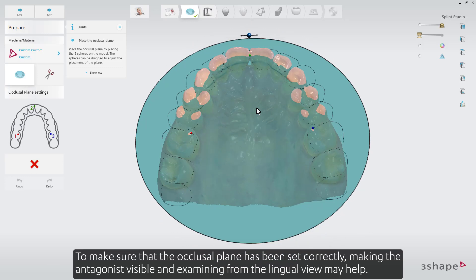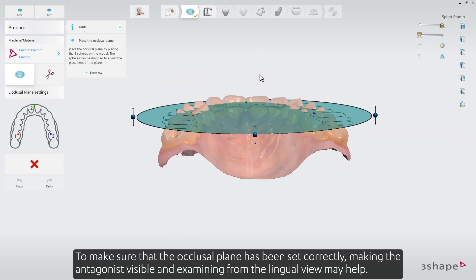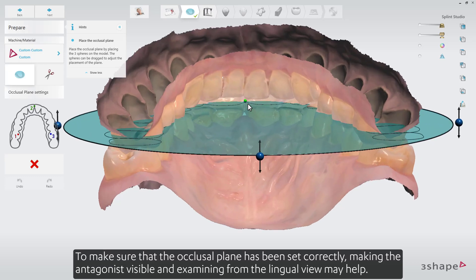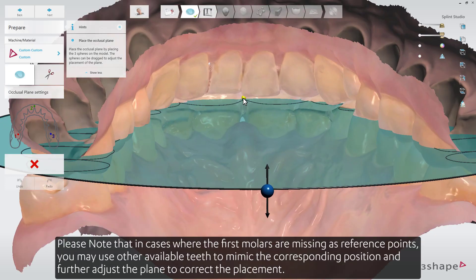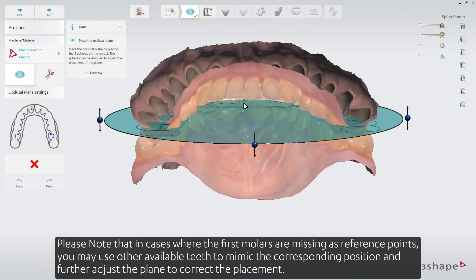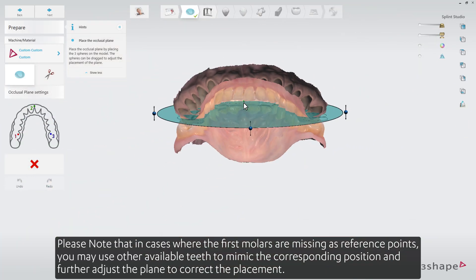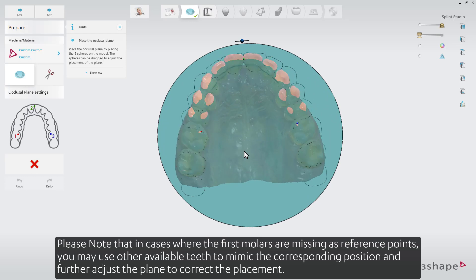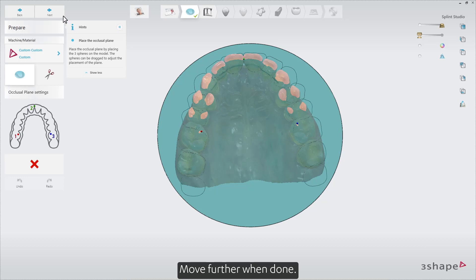To make sure that the occlusal plane has been set correctly, making the antagonist visible and examining from the lingual view may help. Please note that in cases where the first molars are missing as reference points, you may use other available teeth to mimic the corresponding position and further adjust the plane to correct the placement. Move further when done.